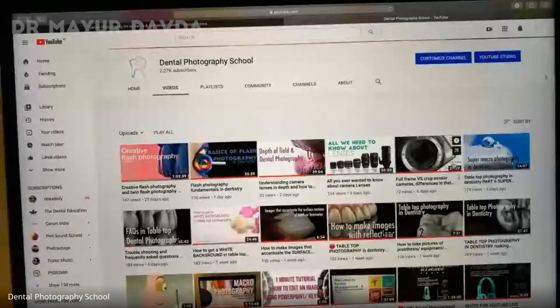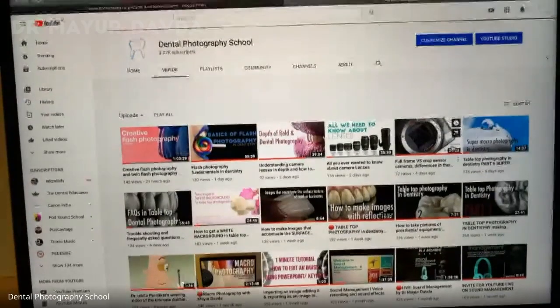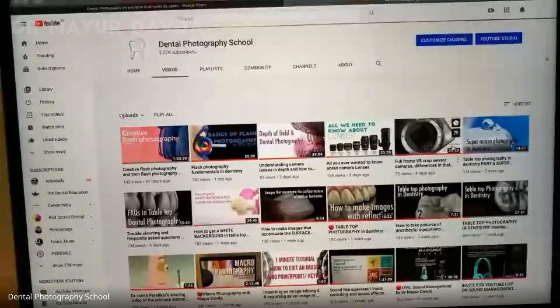Mandeep, thank you. Studio lights, Elinchrom FRX 400. Okay, do we have more questions? Yes, Vishal, if you do manual focusing, only then you can standardize the pictures.